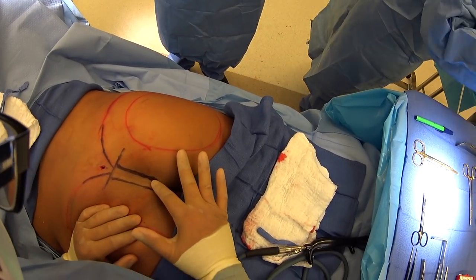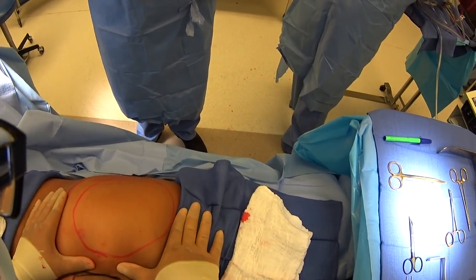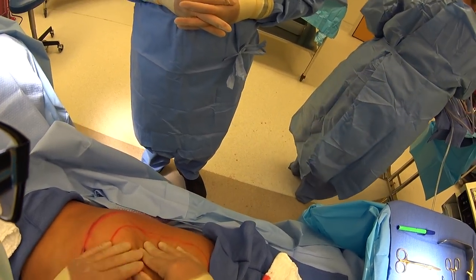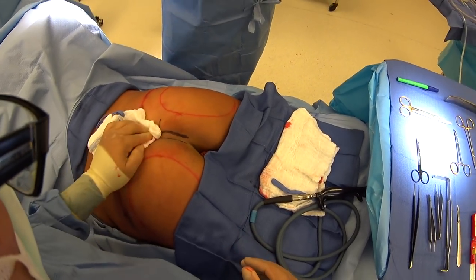We'll make our two gluteal incisions on each side so we have access to the butt. We'll put our butt implants in — we're going to do a 548cc silicone round implant — and then we'll fill it in with some fat transfer to fill in our hips and do any fine touching we want of the implants.